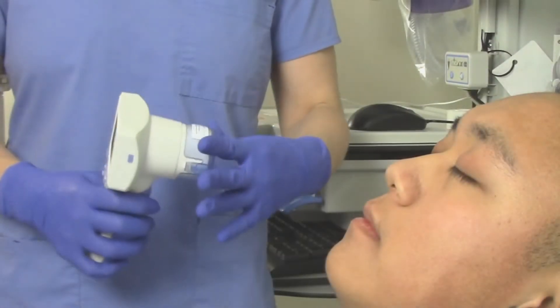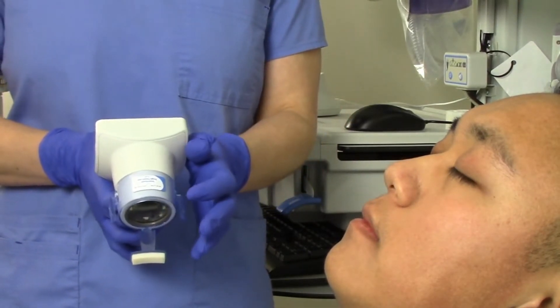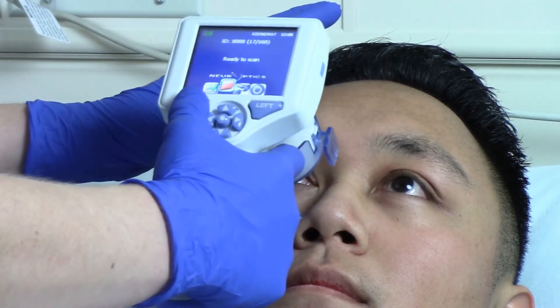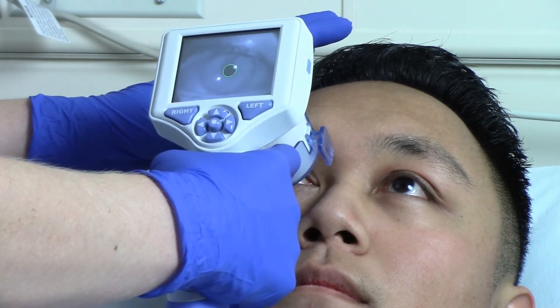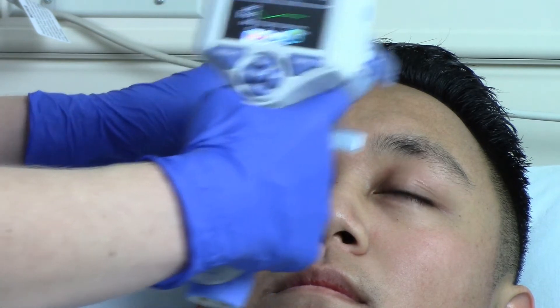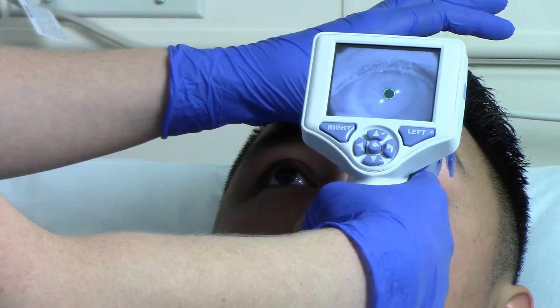Pupil examination is an essential part of the neurologic exam. Manual pupil measurements are subjective and prone to error and inter-examiner variability. The Pupilometer is a simple-to-use handheld device that provides accurate, reliable, and objective pupil size and reactivity data independent of the examiner. Most importantly, the Pupilometer expresses pupil reactivity numerically so that both pupil size and reactivity can be trended for changes, just like other vital signs.